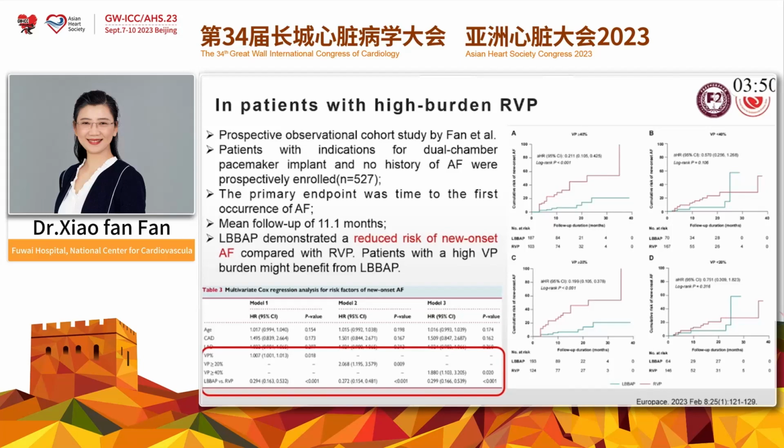Here's another study published in Europe this year. They also prospectively observed the burden of the occurrence, the incidence of atrial fibrillation, and the incidence of atrial fibrillation in patients with LBBAP is significantly lower than in patients with RVP.